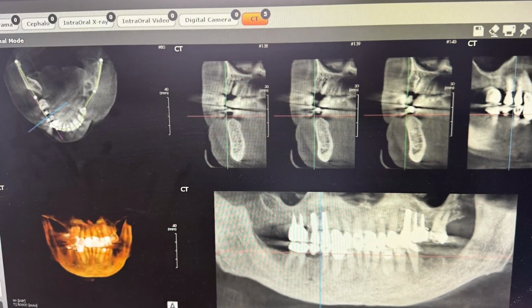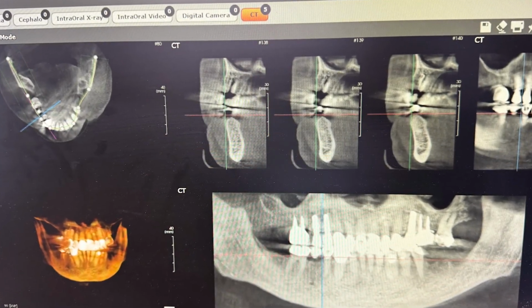My name is Dr. Spencer Cromwell, and today we'll be placing 2 mini dental implants using a surgical stent for tooth number 19. So John, you're gonna feel a little vibration, some water. If you feel anything sharp, you raise that left hand, okay? And we'll stop right away.